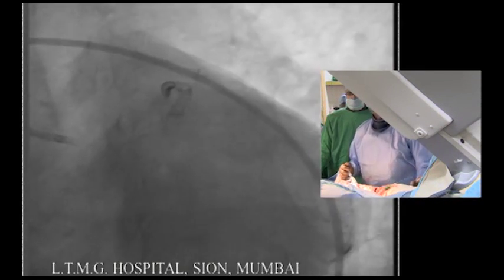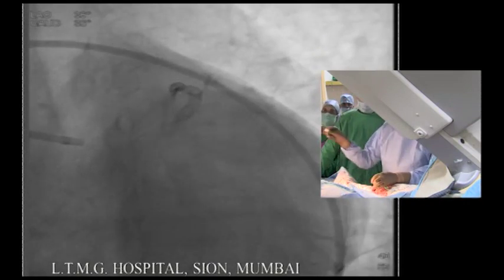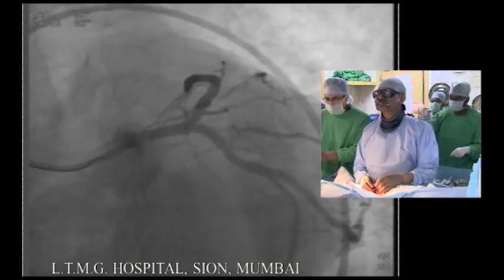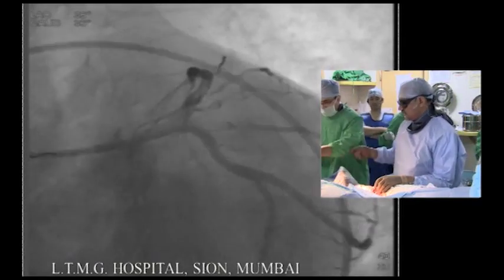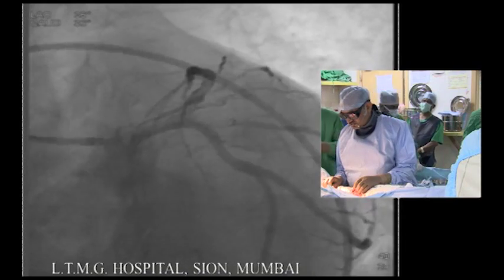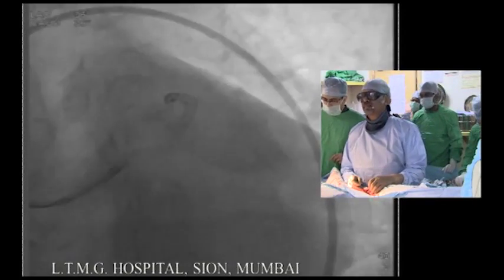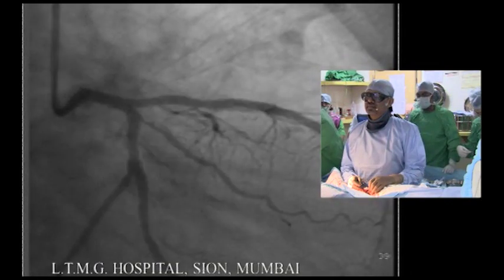I think that the angiographic image of this section is very bad. Dr. Mahajan, there is a concern that the distal flow in the LAD has slowed significantly. One second. Show me the prior shot. AP cranial.